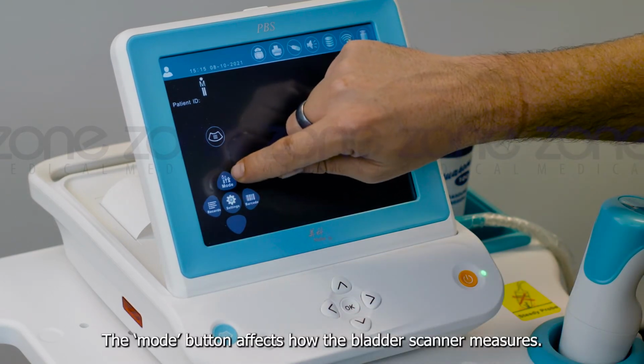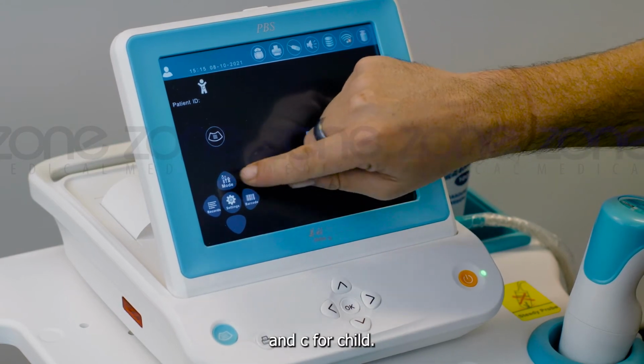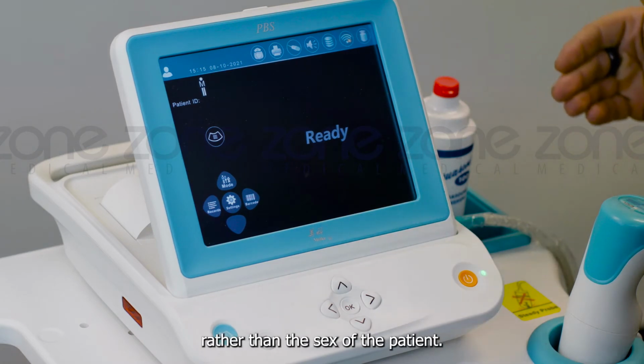The Mode button affects how the Bladder scanner measures. M for male, W for female and C for child. This is more relative to the size of the patient rather than the sex of the patient.